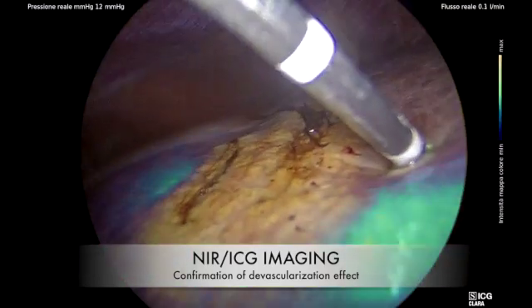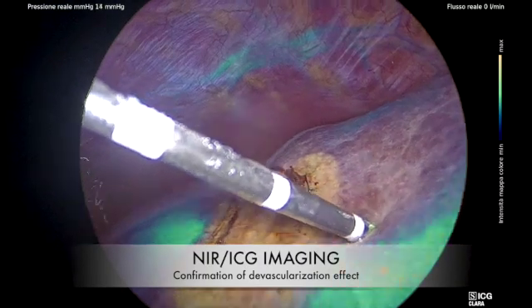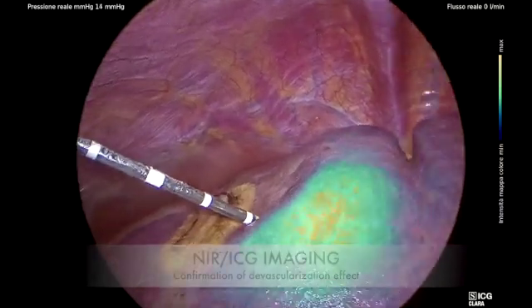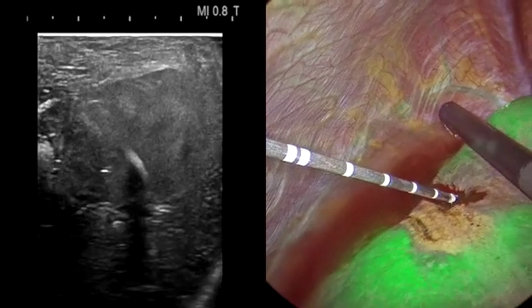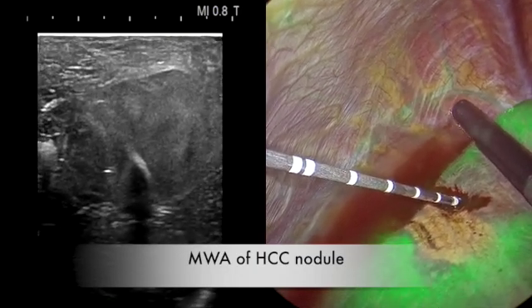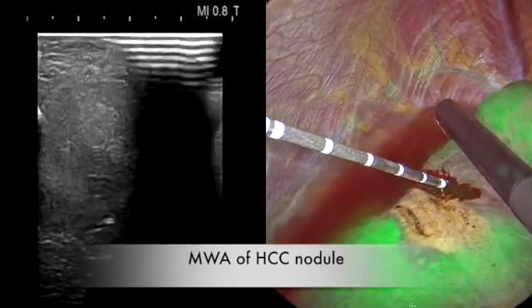Then, after the injection of indocyanine green, we can control the devascularization effect of the ablation of the tributary vessel at fluorescence imaging. Finally, after the confirmation of the complete intrahepatic vascular occlusion, we positioned the microwave antenna into the lesion, and we performed a thermoablation with a duration of 7 minutes at 90 watts.